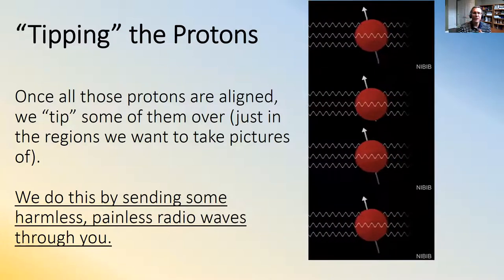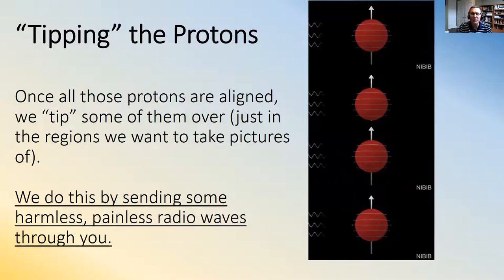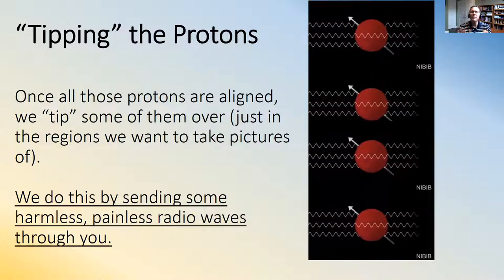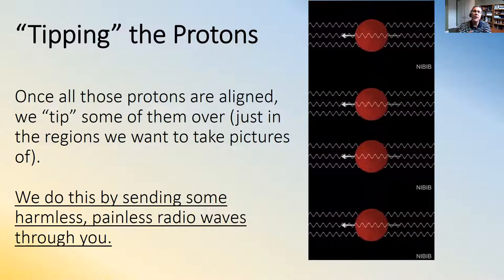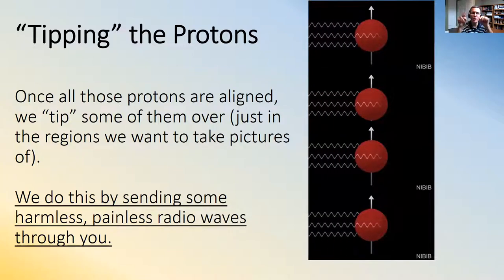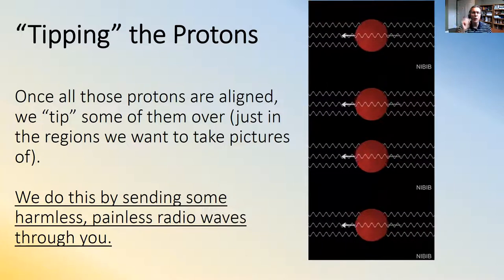So now let's see what happens. I'm showing a little animation here, and let's look at the words. If you're just laying inside that MRI machine and all your protons are lined up with the magnetic field, you can lay there forever and nothing bad will ever happen, but we also can't take a measurement inside your body. So now we have to do something so we can talk to those protons. And here's what we're going to do. We're going to tip them over.